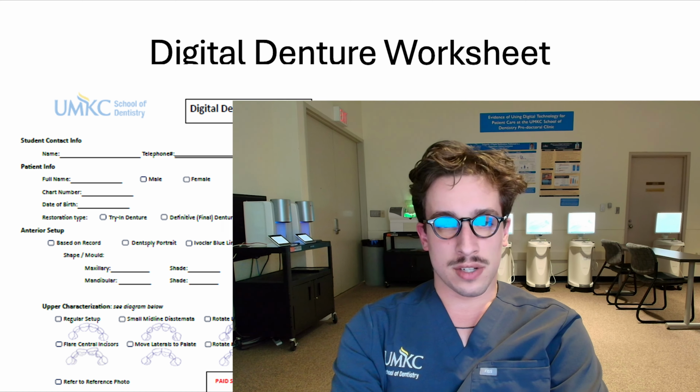Like I said, this is really an overview video, and I go into each one of these steps very in depth. If you're going to be doing a digital denture, watch these videos before you come ask us questions about it, just so that we're all on the same page and you'll have an idea of what's coming. The purpose of this is that you feel prepared for every appointment. I know digital dentures can sound scary.